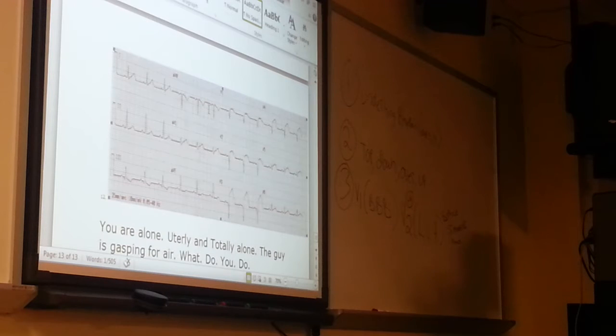You are looking at so many different areas of the heart right now, okay? And I always tell people, EKG interpretation is like learning to speak a new language. There are a lot of different dialects. The way I speak here in Philadelphia is not the way I'm going to be speaking if I'm down in North Carolina, right? We're all speaking American, but it's going to be slightly different depending on who's up here talking to you, but the basics are the same.